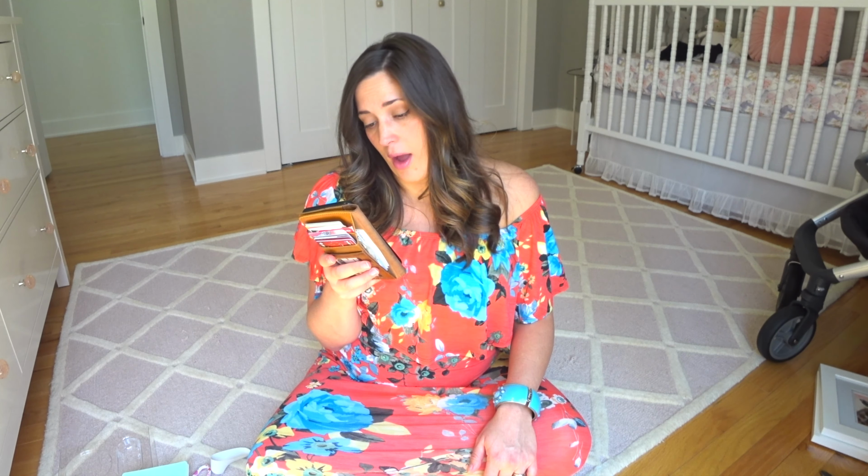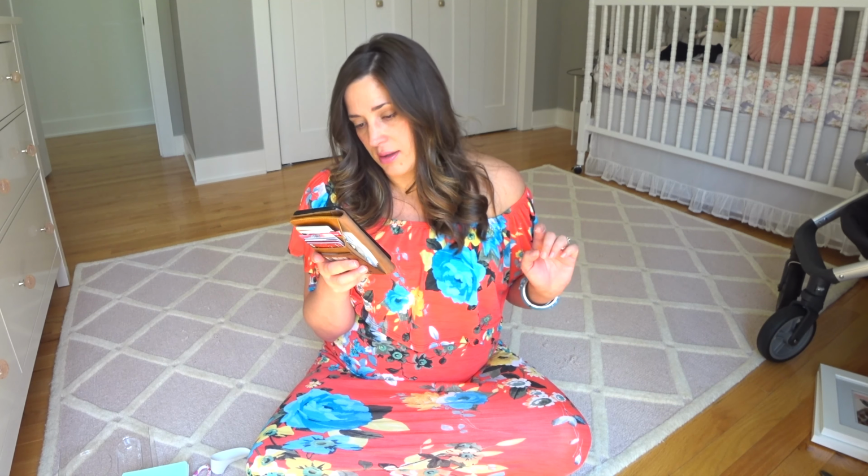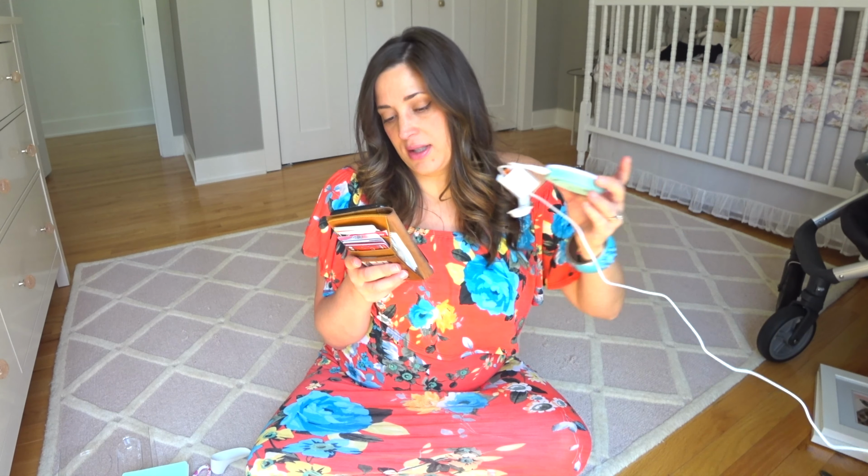It says connect your phone to Wi-Fi. Have your Wi-Fi password handy. Be close to your router. Be near a power outlet. Plug the sock into the base station. Done. Use the plug in the back of the blade. Okay, that's done. Plugged in. Plug the station into the wall. Done. Your base station is blinking white. It will change to solid white once sock pairing is complete.